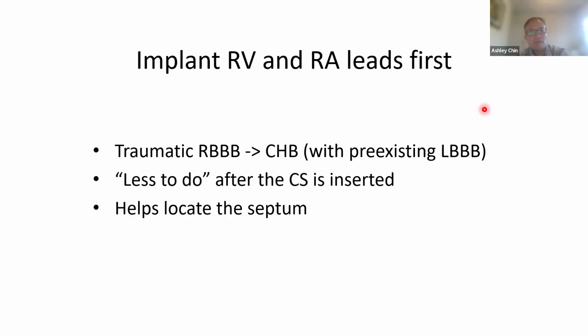I always think that the most difficult part of the CRT implantation is the LV lead. So I don't want to put the LV lead in and then do the RA and then do the RV because sometimes if it takes a long time, you're tired and you've wasted energy doing the RA and RV afterwards. So there's less to do after you insert the coronary sinus.